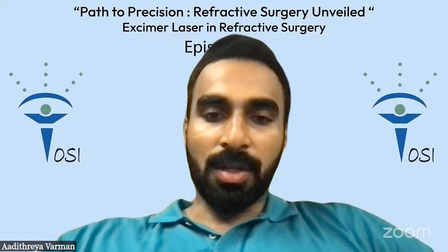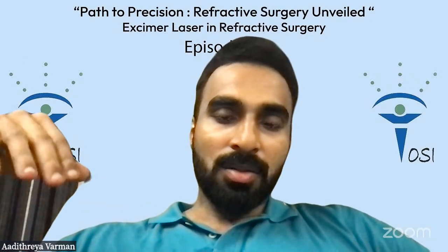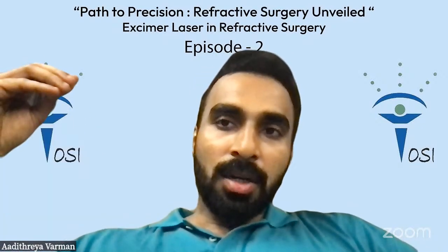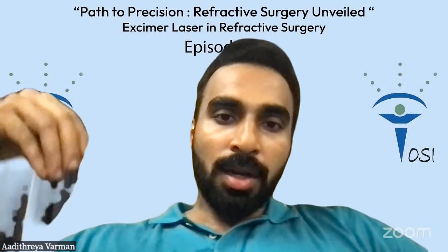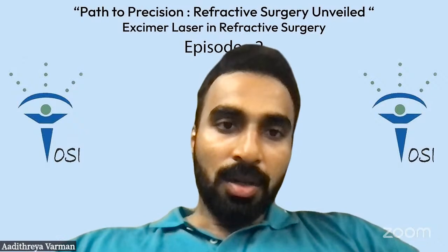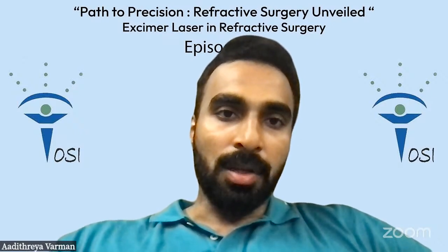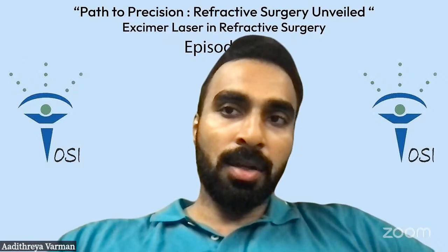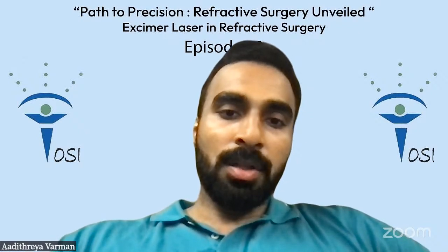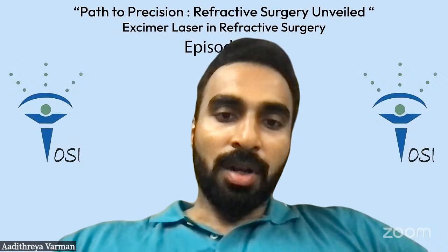So I'm going to ask you a question now. Trans-PRK or PRK? One of my doubts about trans-PRK always was, I feel unless you have a modality to check the epithelium before the trans-PRK, it's difficult to get an accurate outcome, because in many of our patients you see patchy epithelium. It'll be 50 microns in one area, and then there's another band of 60 microns of epithelium. And when you input your epithelial thickness as 50, you're going to get an uneven ablation profile. So how do we address that, ma'am?